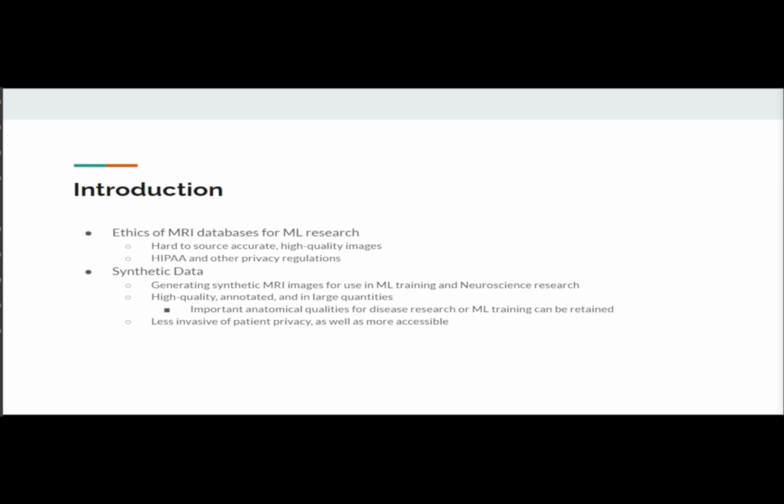Additionally to that, there is the issue of just the accuracy of the image, the quality of the image. The accuracy and the quality of two different MRI machines might not be the same, not to mention the way they're set up makes the image look different, how they're directly angled, and the way the patient was sitting, and the specific type of machine itself, the specific brand and model of machine.